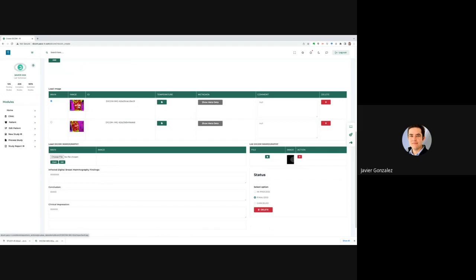Absolutely. Now, do you have a spot in the patient area where you can upload intake forms and stuff like that? We can put that kind of stuff. I mean, we don't have it right now. Okay. Yeah, that'd be a great idea because the interpreter is definitely going to need that.